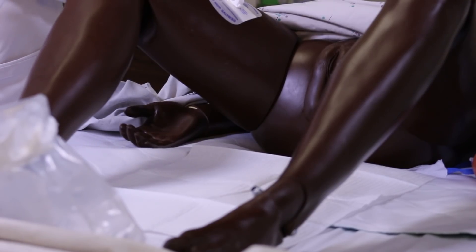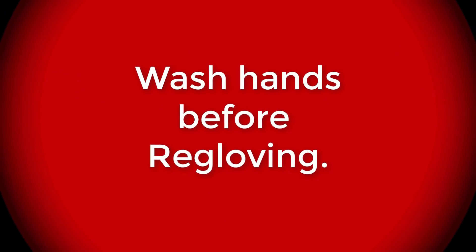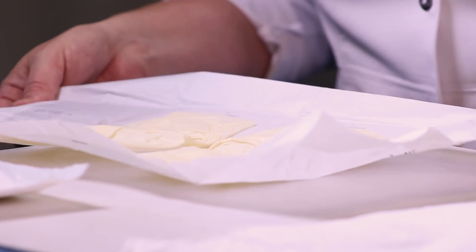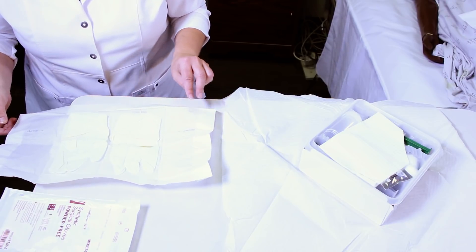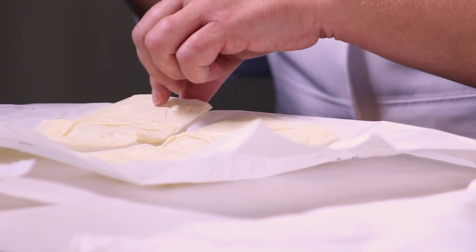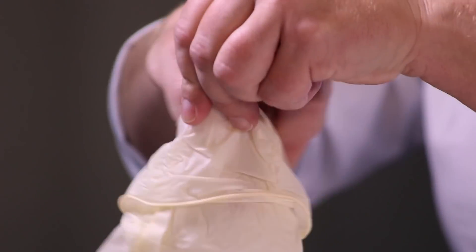Now I remove my clean gloves, wash my hands, get your sterile gloves, then take the edges and open it up so that you have a flat surface to work from, being careful not to contaminate your other sterile field. Take the inside cuff with your non-dominant hand.